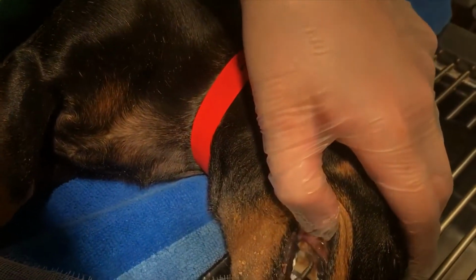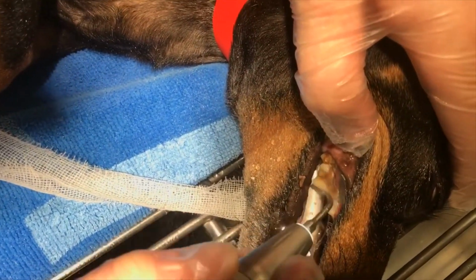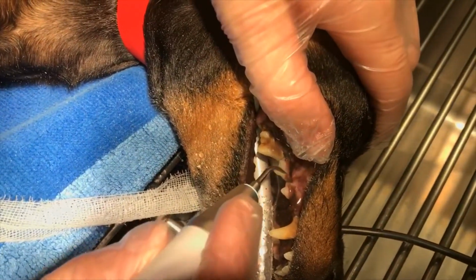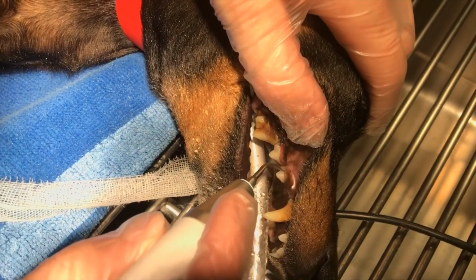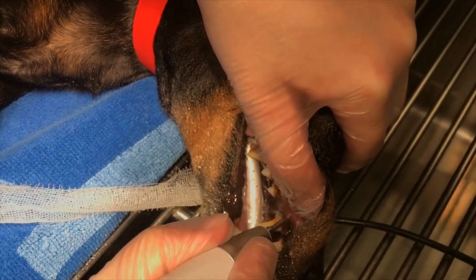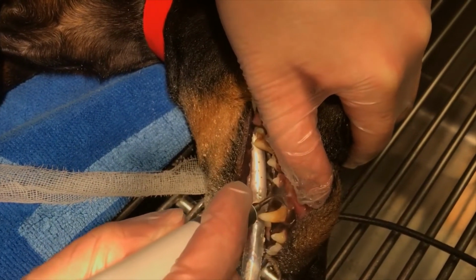A good idea is to keep the ultrasonic scaler moving. It is also a good idea to get under the gum line as well. This is a good future indication for whether you are going to have pockets anywhere, or whether you are going to have those rotations. It gives you a good future view for that, as well as making sure you clean out under the gum line.